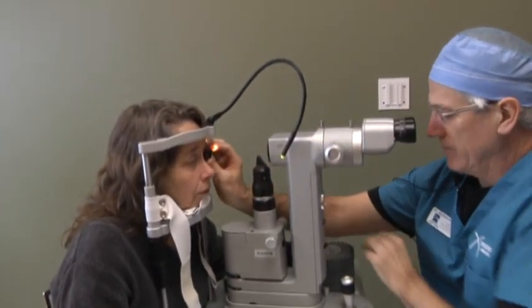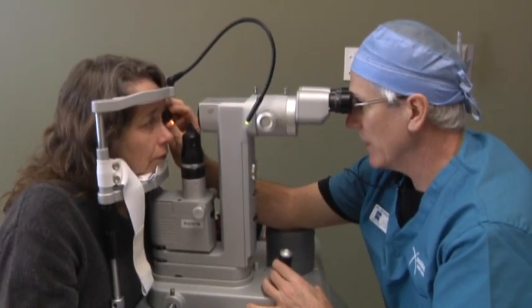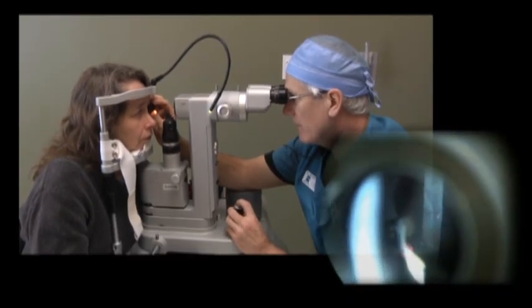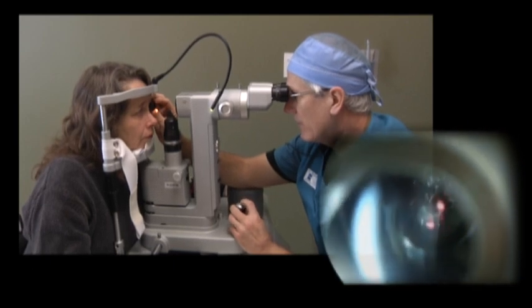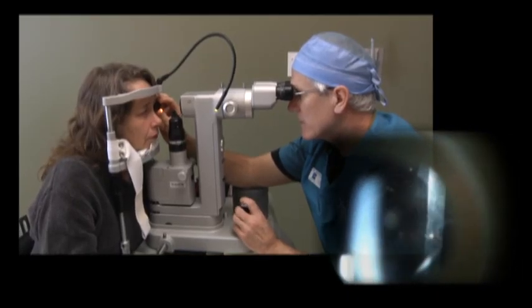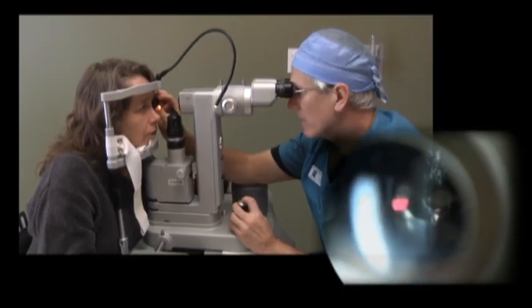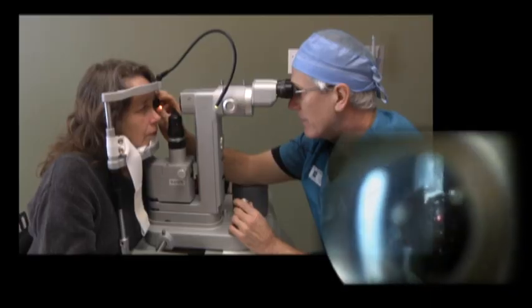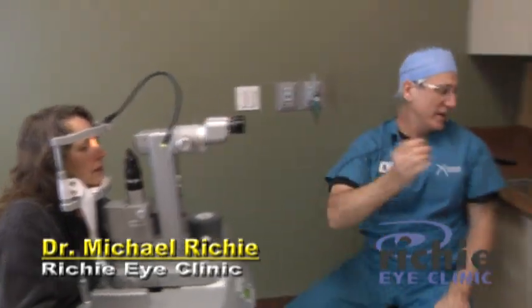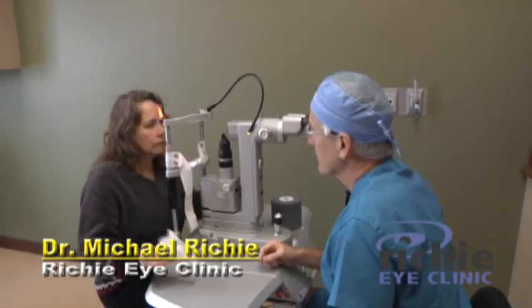The laser is nothing more than a bright light — it's just highly focused. Now when I shoot the laser, you're going to hear a snapping sound. Don't be alarmed. It doesn't take very many laser spots — usually 10 to 30. There we go. That is all we need. I take the magnifying contact lens off.